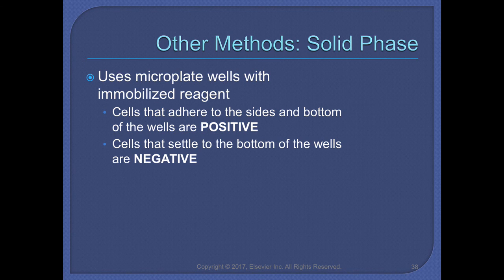This technology uses microplate test wells with immobilized reagent red blood cells. Solid phase technology could be used for antibody screening, antibody identification, and also for compatibility testing.